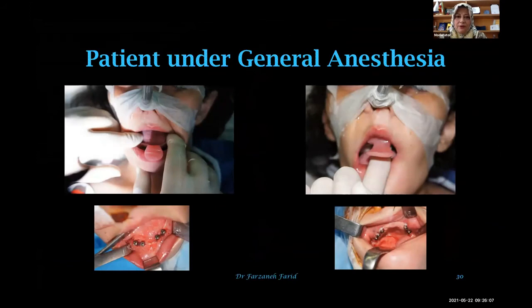Have you ever had to take impressions of a patient under general anesthesia? This patient was not cooperative at all. So they put in implants under general anesthesia, and I made the final impressions at that time. Now I'm thinking perhaps it would have been better to use intraoral scanners, with scan bodies attached to the implants, and take impressions with intraoral scanners. However, I'm not sure if it would be better or not.